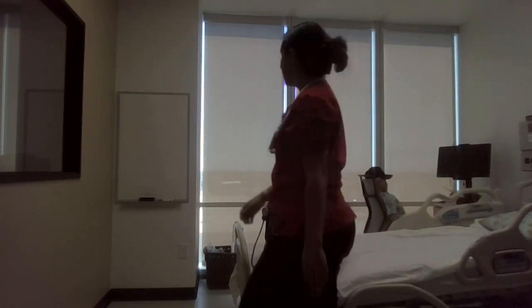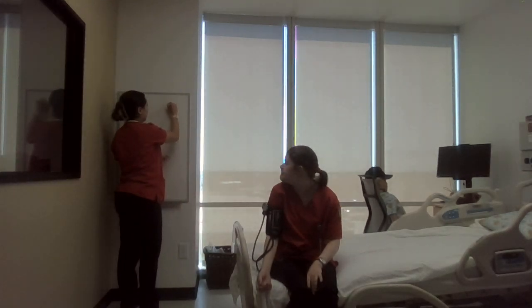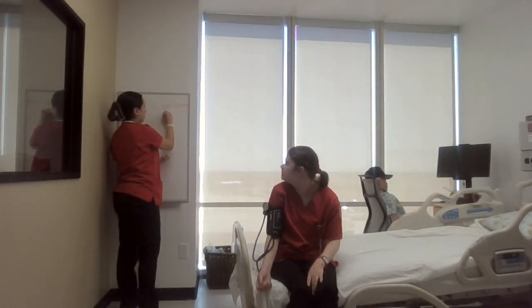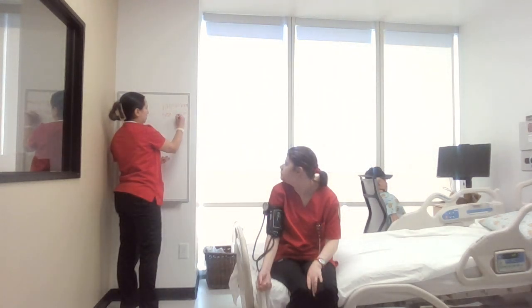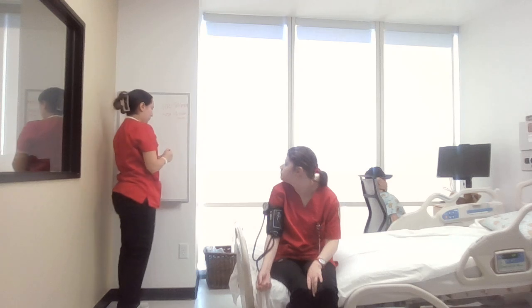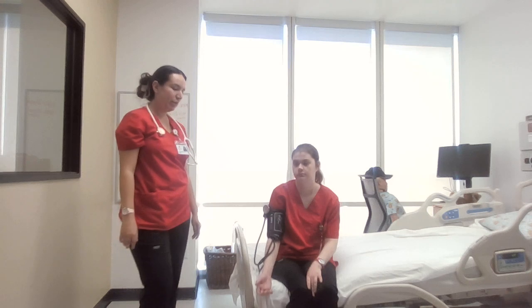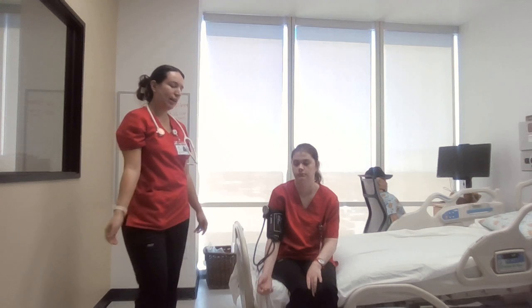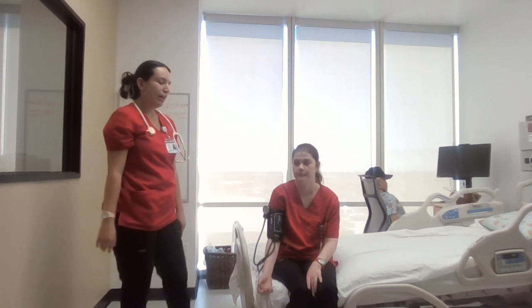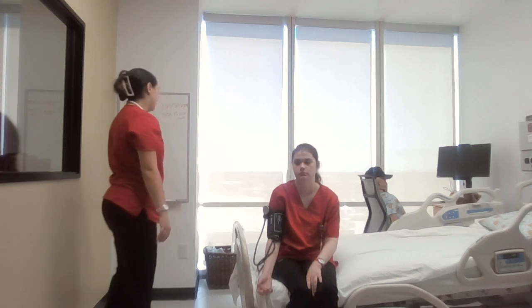Okay, so the patient's heart rate was 80 beats per minute. And it was +2 regular rhythm. And then the respirations were 18 breaths per minute. And then at this time, I would also perform the O2 saturation. I would make sure the patient has no nail polish or acrylic nails, take their O2 sat and say I got 98% on room air. And then I would take their temperature as well. I would take it orally and I got 98.5 degrees Fahrenheit.